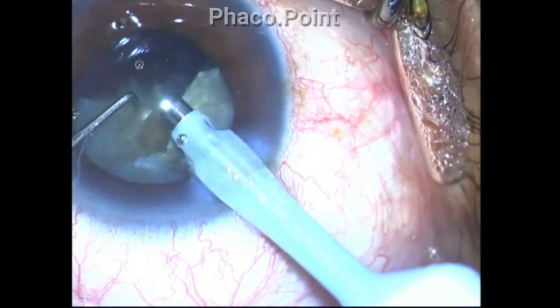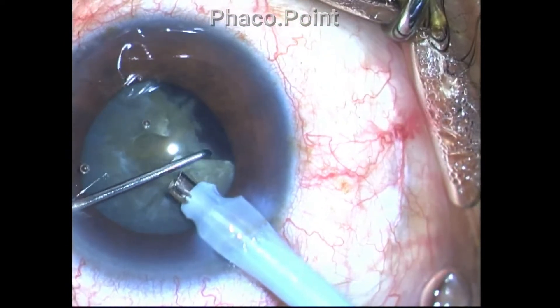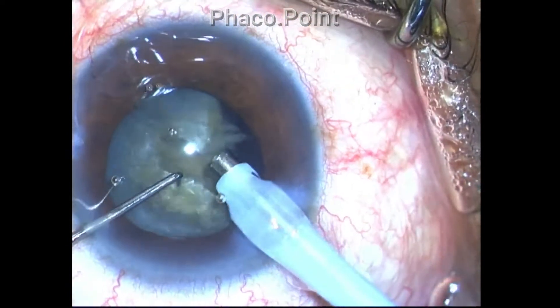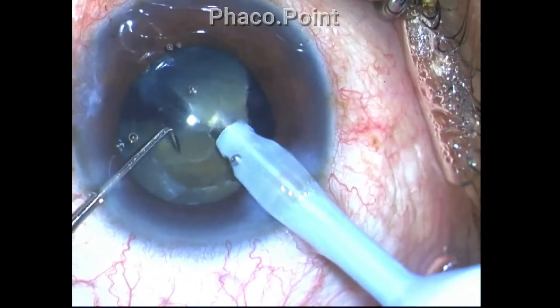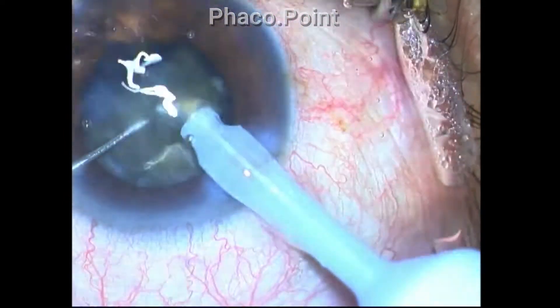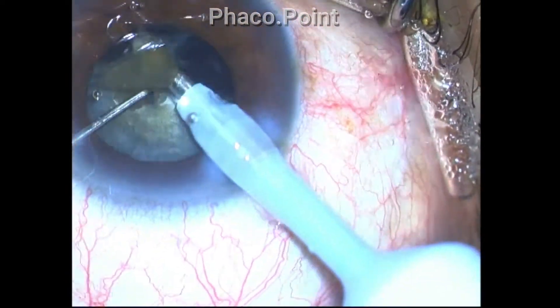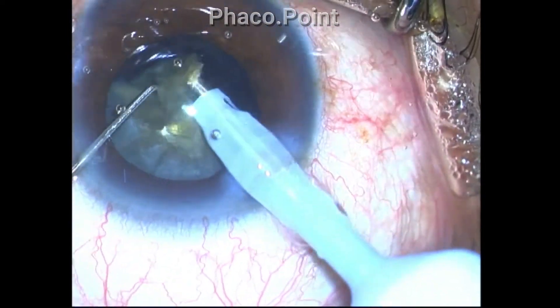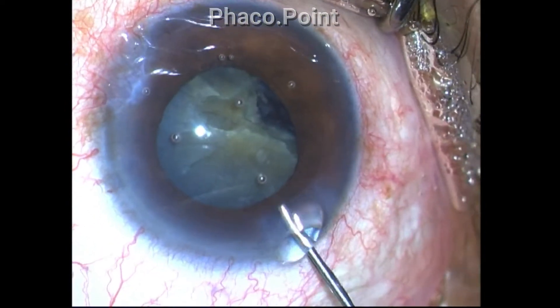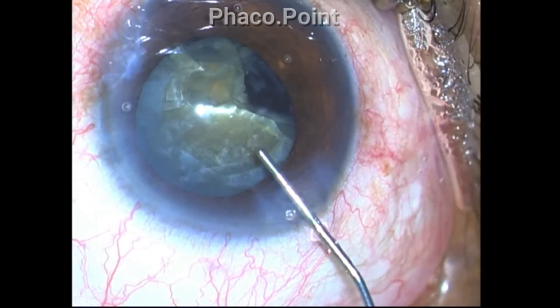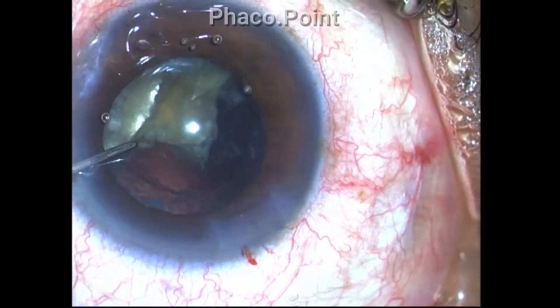It is important to use a sufficiently high aspiration flow rate because it will help increase the followability of the pieces. Trying to play it safe with a low aspiration flow rate is fine, but it will reduce followability. Use power settings appropriate to the grade of nucleus sclerosis — in a hard cataract you cannot set a low power and low aspiration flow rate. This will prolong your phaco time, and a prolonged phaco time leads to unnecessary complications and endothelial damage.